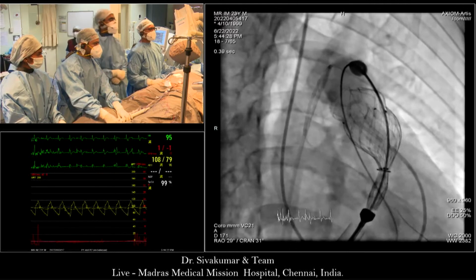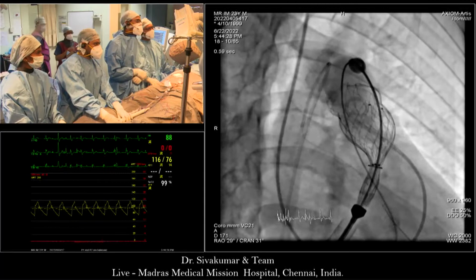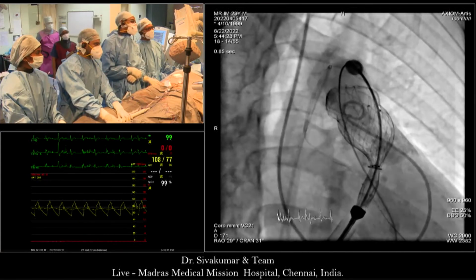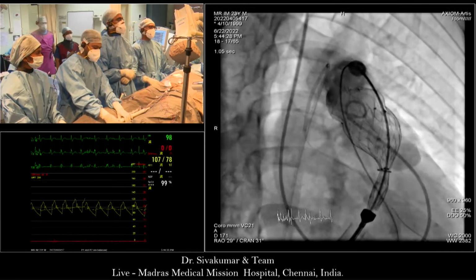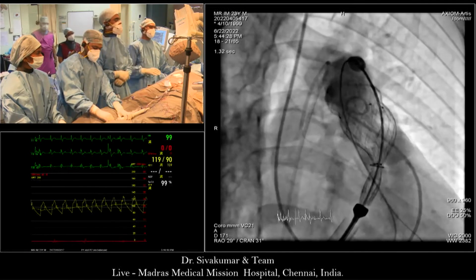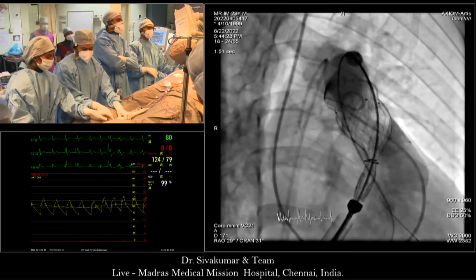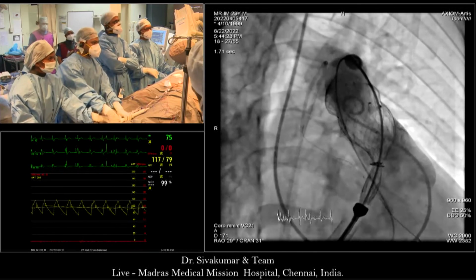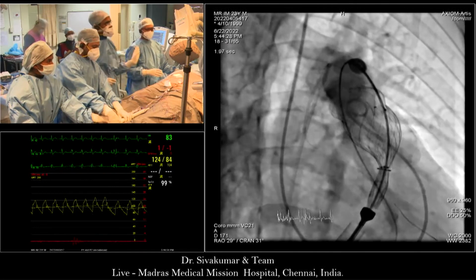Shaq, let us see this picture. 50% of my flare has fallen into the right pulmonary artery. I have a small amount of the right pulmonary artery being covered, only the caudal portion. And my annulus is in line with the proximal end of the valve. Do you agree, Shaq? Yeah, now because you've adjusted it a bit, I would do a lateral or near lateral as well. Okay, lateral.